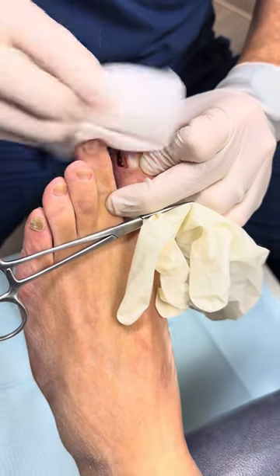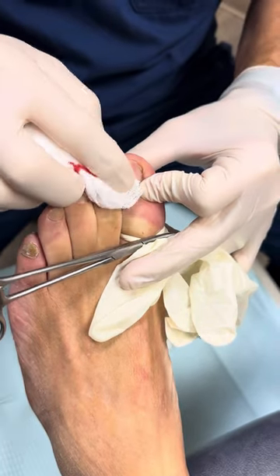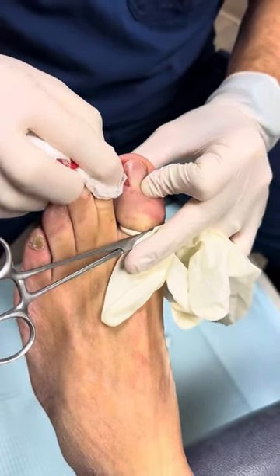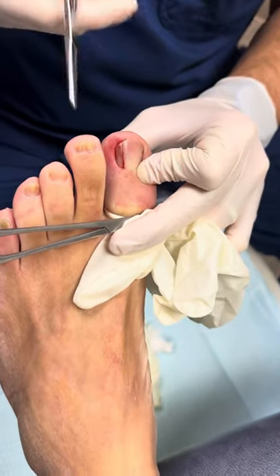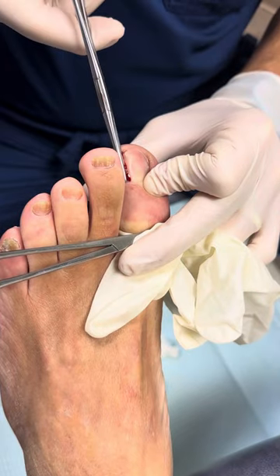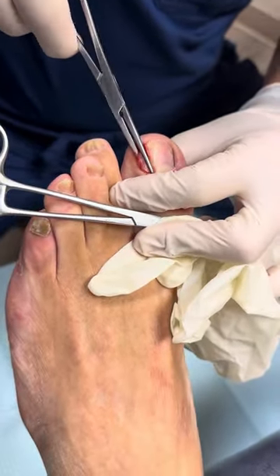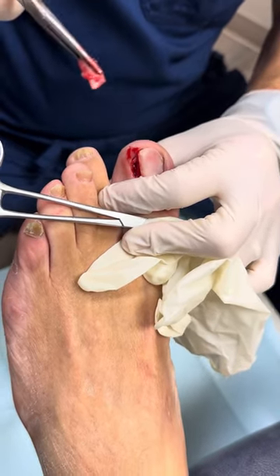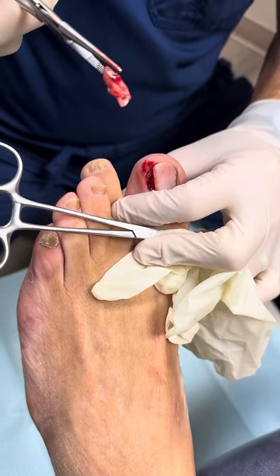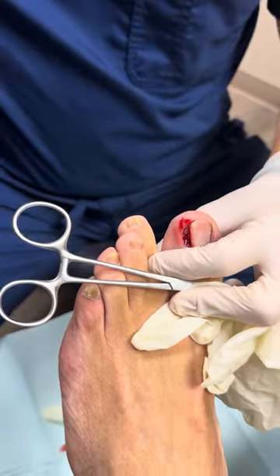This isn't going to bleed a lot, hopefully, because we have a tourniquet on — this is actually a makeshift tourniquet with a glove. The reason we use that is for minimal bleeding. We're going to now grasp the nail, take out the part that's ingrown, grab it, and just turn it a little bit. By turning it, we're removing the nail — and this is a decent-sized piece of nail that was ingrown.